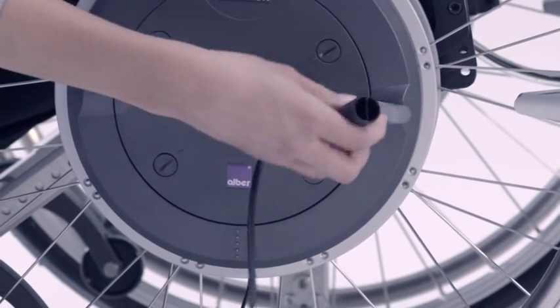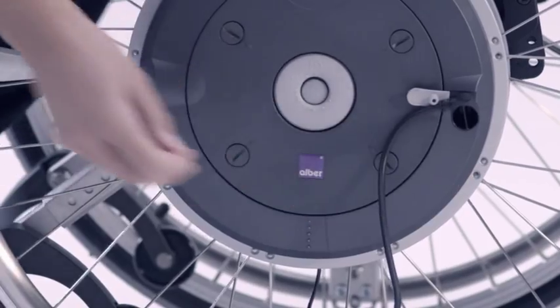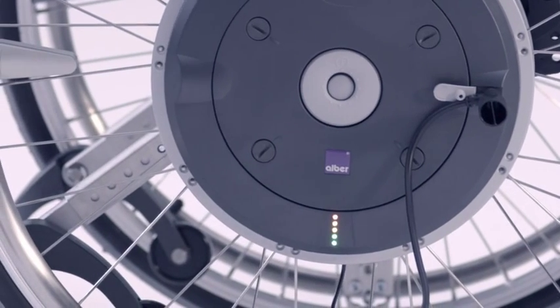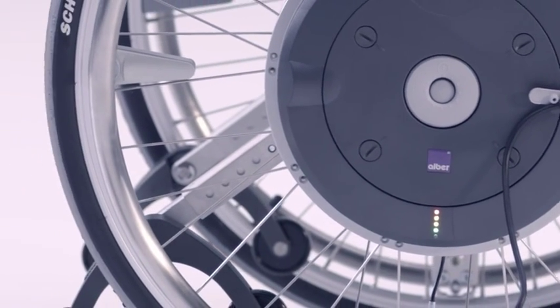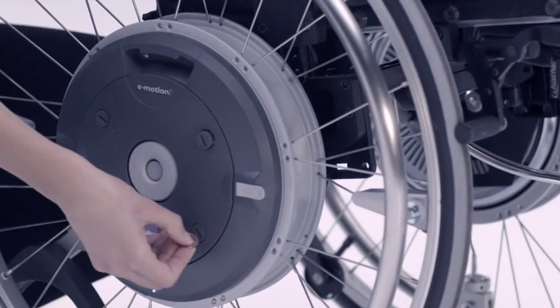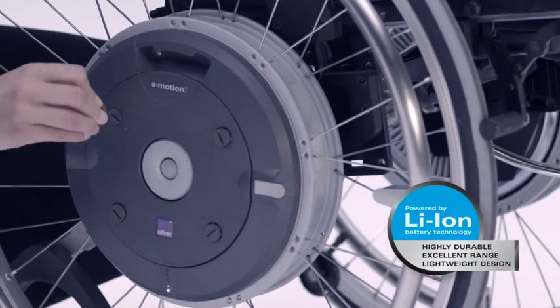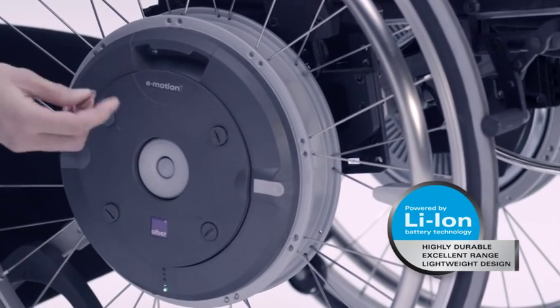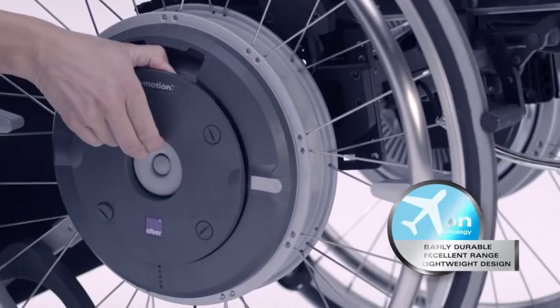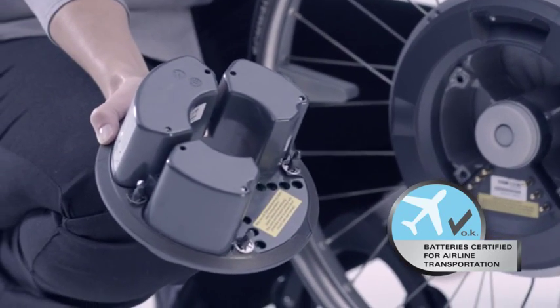The battery packs can easily be recharged using the battery charger. As soon as the pack is ready, it switches off automatically. The lithium-ion batteries last for a very long time, are light and have a long service life. The batteries can be removed when the chair is serviced or when travelling by air.